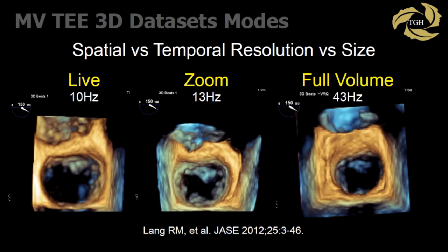Any thoughts about the other two? If you have the choice, would you take data set one, two, or three? The difference is this: the first was a live acquisition of a complete valve, acquired with just the 3D live button — a 10 Hz frame rate. The second is a zoom at 13 Hz, and the last one is a full volume. So you can have a very different display depending on what your acquisition was. These are the real numbers that you will see.